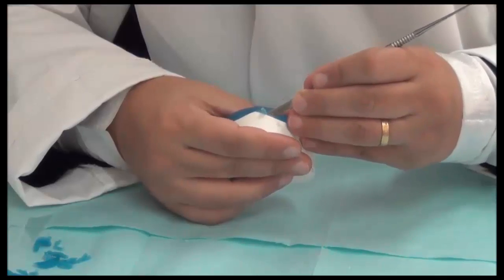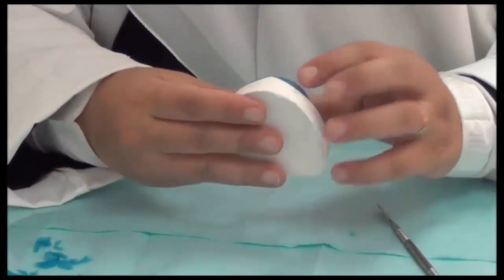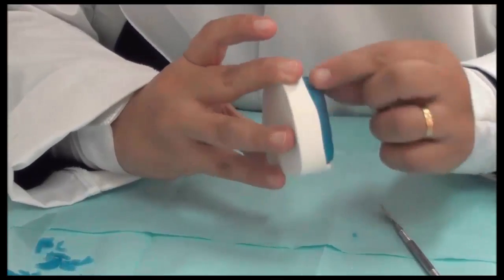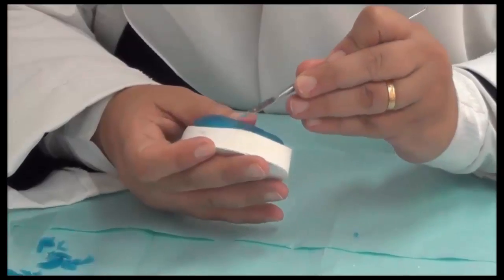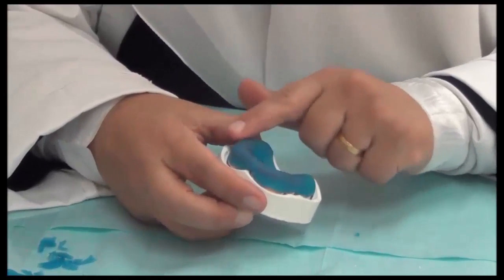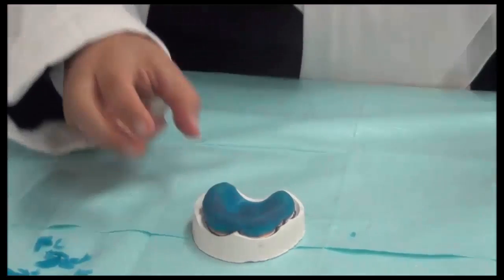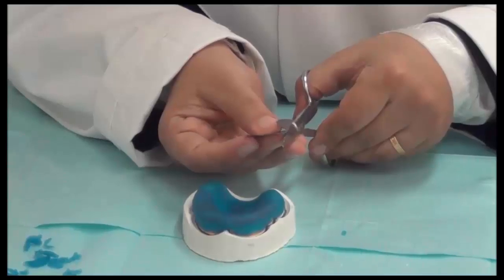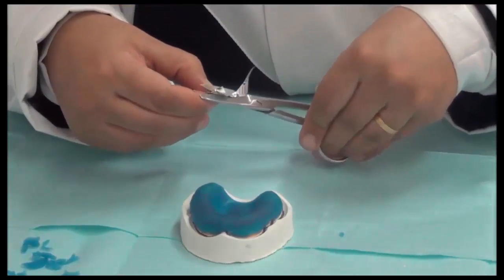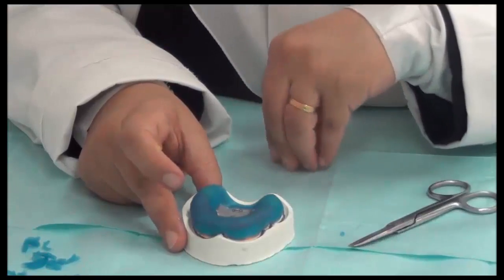Light cured acrylic, once I put it inside the light, will initiate the polymerization reaction, and this polymerization reaction might cause it to shrink a bit, and this shrinkage of the material might take the tray away from the tissue. So there are methods where we cure part of the material first, and we light seal this surface and then cure the surface alone. So before light curing, we can add any material that is opaque and cut it into this shape and just add it into the palatal area. This will reduce the shrinkage while we are doing the light curing of the material.